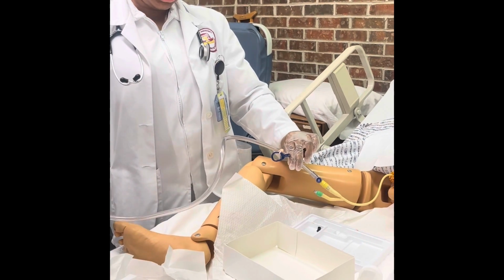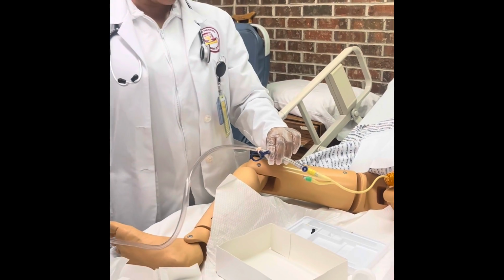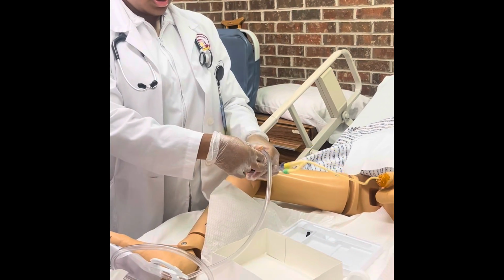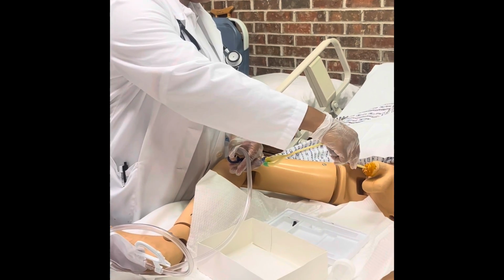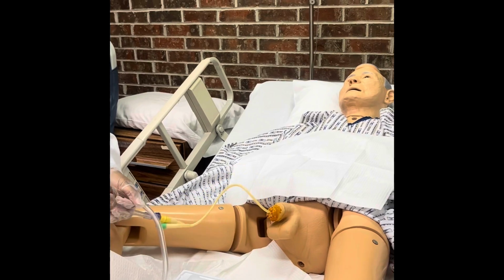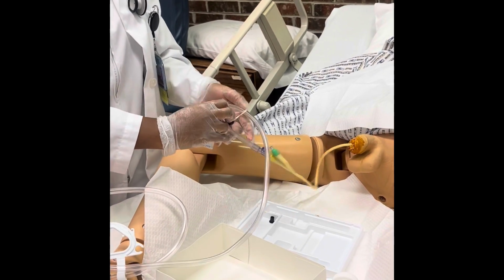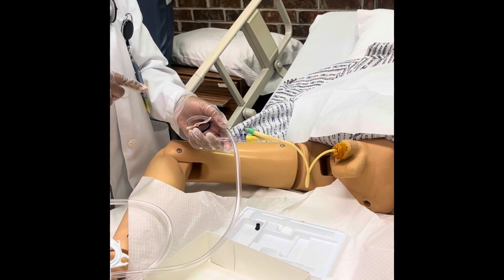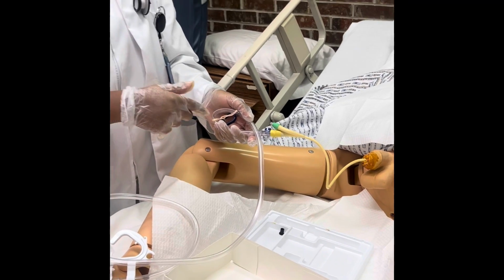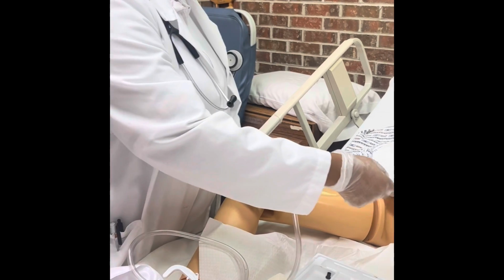Now for my urine collection sample, I'm going to make sure all the urine is drained down into the bag before I start. And then I'm going to clamp off his tubing. Clamp his tube, and I can use the rubber band or the blue thing, whichever is easier for me. He's clamped. I would do this 15 to 20 minutes before I initially take the urine to let some new urine get into the first part of the tubing. And then I would come back 15 to 20 minutes later.